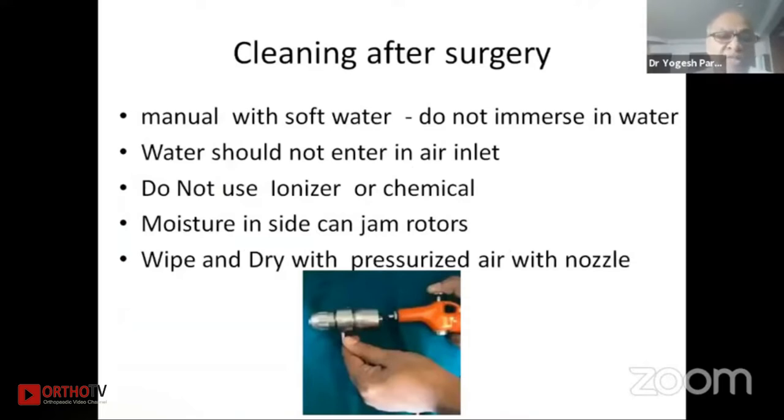Cleaning after surgery is of utmost importance. Manual cleaning is usually done with soft water — do not immerse the drill machine in water and water should not enter the air inlet. Keep the inlet downwards and allow the water to flow over the drill. Do not use an ionizer or chemicals. Moisture inside can jam the motor, so if there is any moisture inside the inlet or drill machine it will jam.